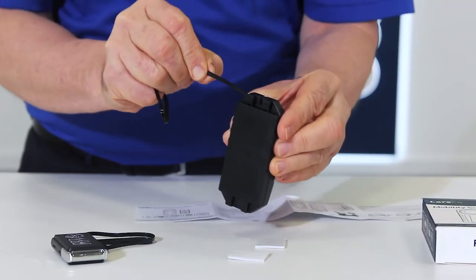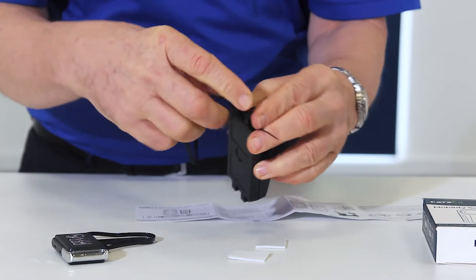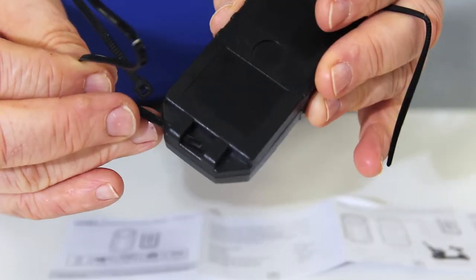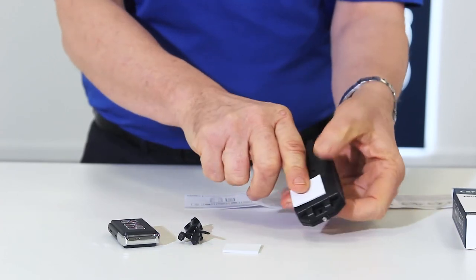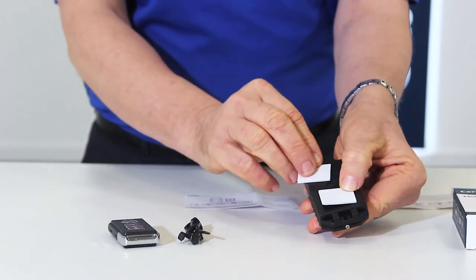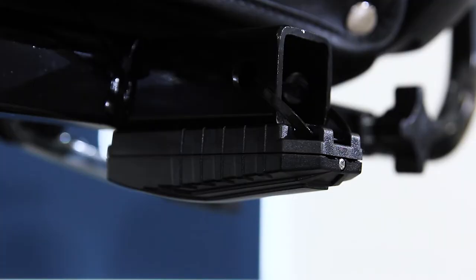To attach the alarm to the scooter, feed the cable ties between the holes on the top and bottom of the alarm, but don't lock the ties yet. You can add the adhesive labels to the dedicated squares on the underside of the alarm — these will allow you to stick the alarm to your scooter. We advise you to attach the alarm underneath your scooter's seat, using the cable ties to secure it in place.